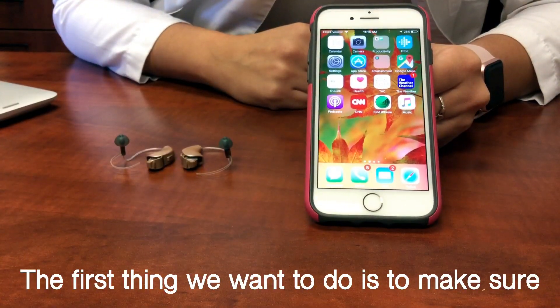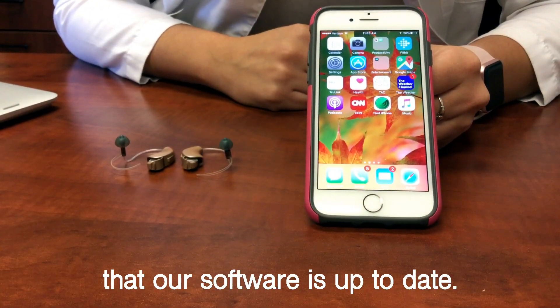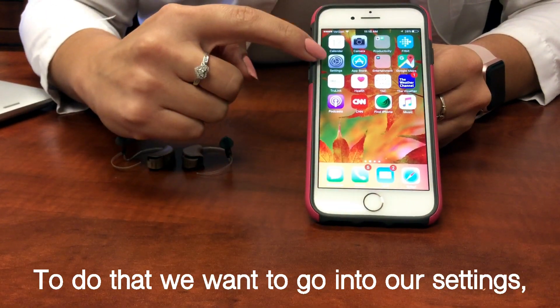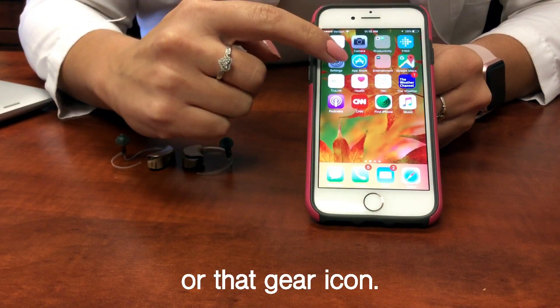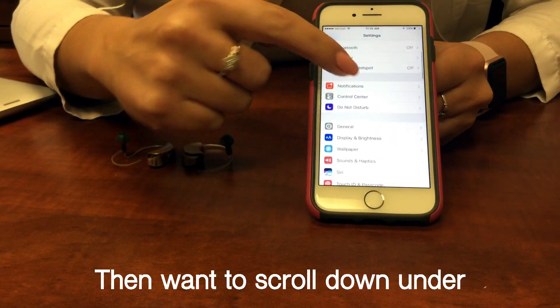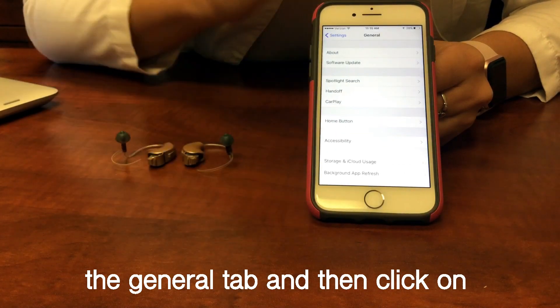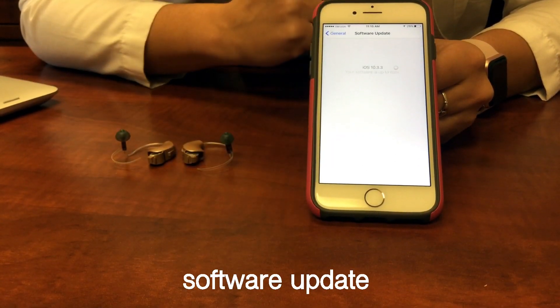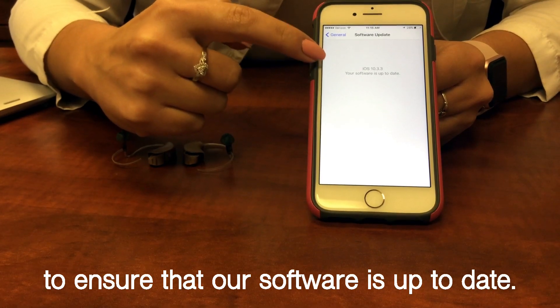The first thing we want to do is make sure that our software is up-to-date. To do that we want to go into our settings, or that gear icon, and then click on software update to ensure that our software is up-to-date.